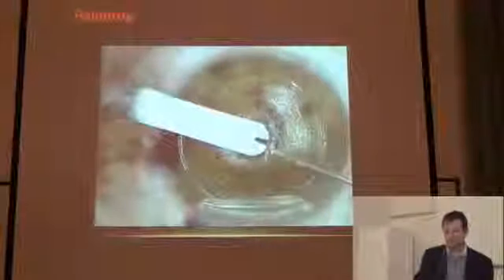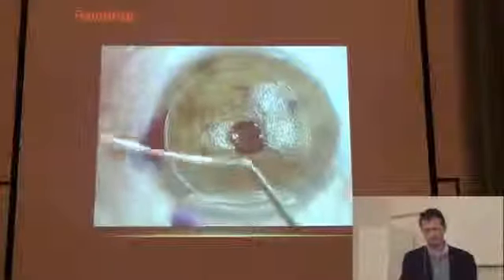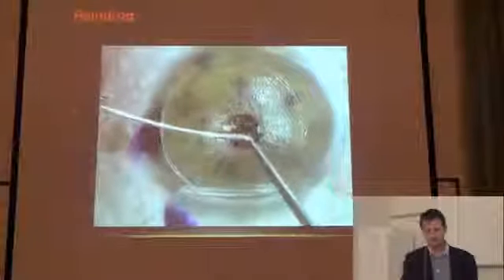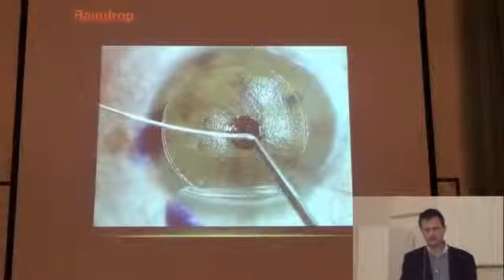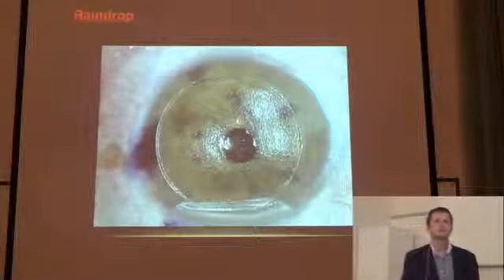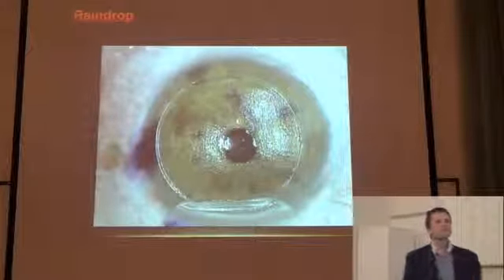You need a classical flap. It's very easy to put it, to center it, and you will see. Is it a microkeratome flap or a femto flap? Sorry? A microkeratome flap or a femto flap? Femto flap.